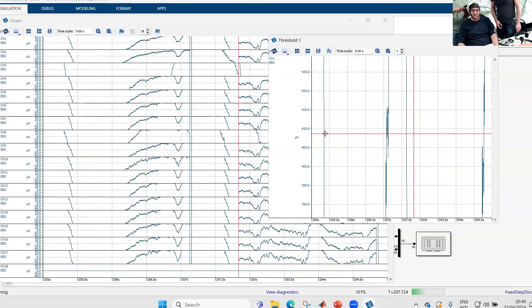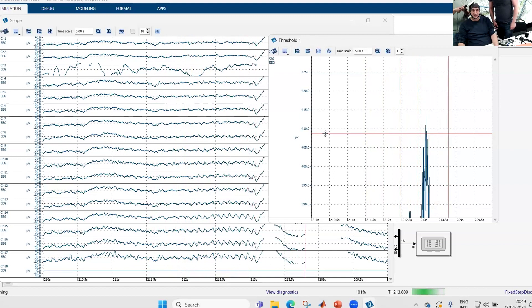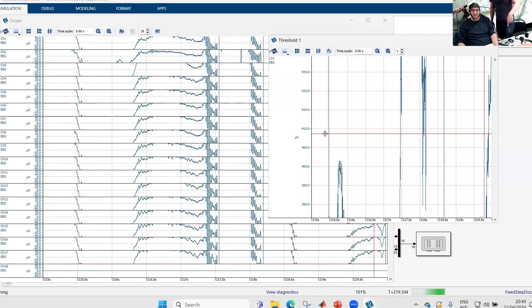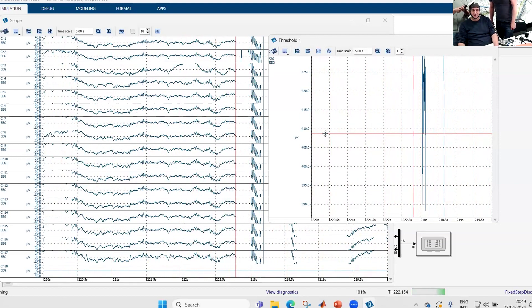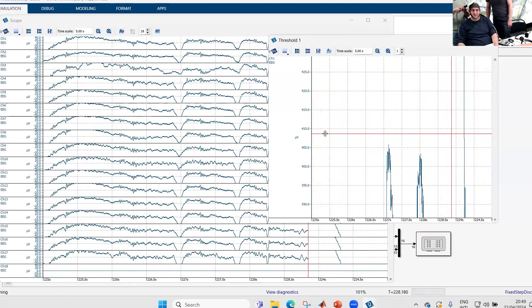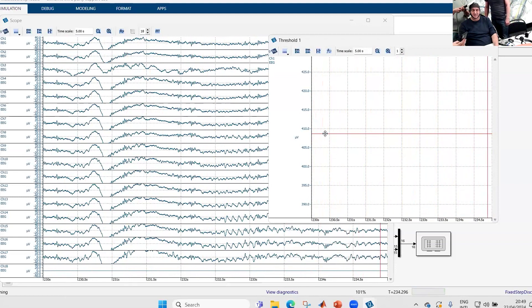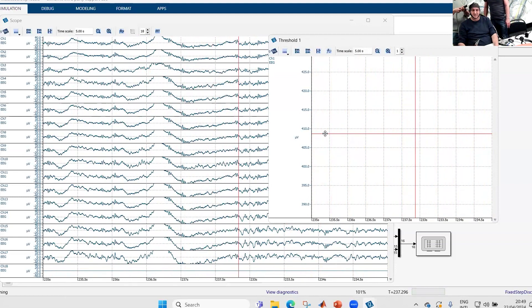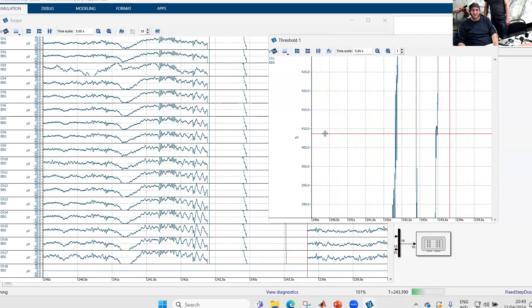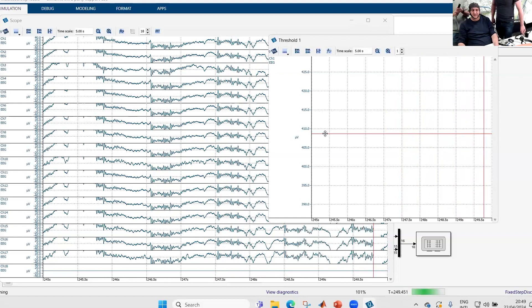Now it was stimulating again. You also see in the EEG data the stimulation artifact, and now whenever the threshold is reached the device can be triggered. The approximate delay here is around 20 milliseconds.